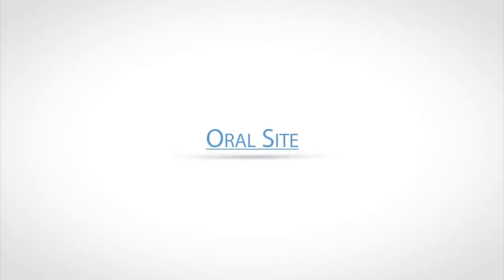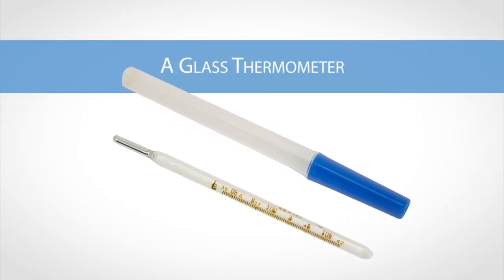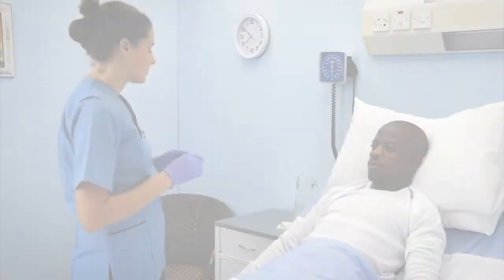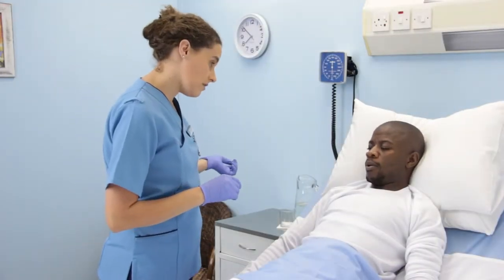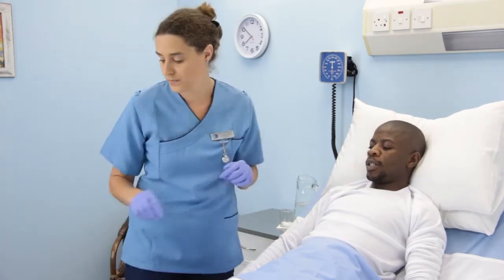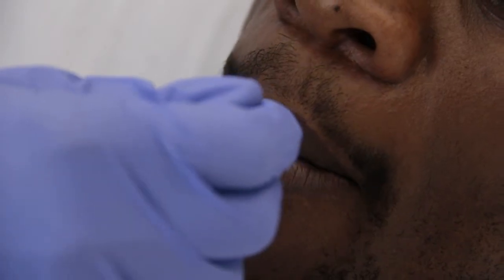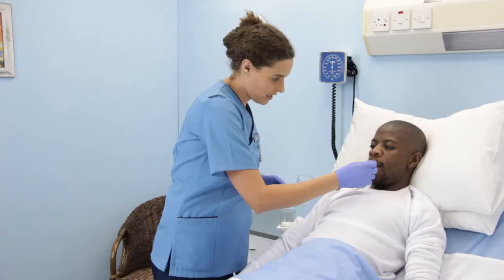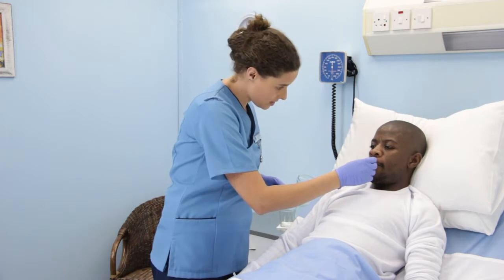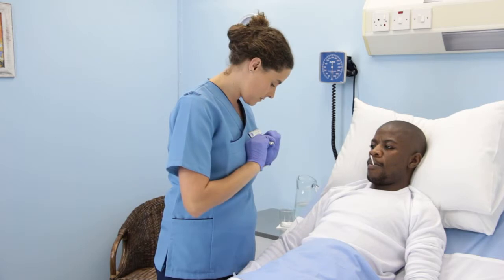The oral site. In this demonstration, we will make use of a glass thermometer. Ensure that the patient did not recently eat or drink a hot or cold beverage. Place the thermometer under the patient's tongue in one of the sublingual pockets. Kindly ask the patient to close their mouth around the thermometer without biting on the thermometer.